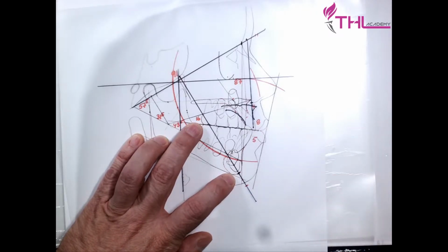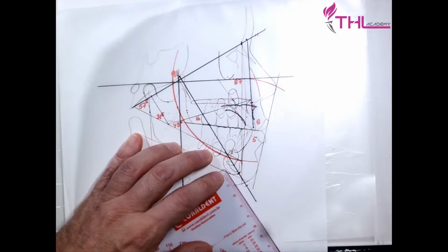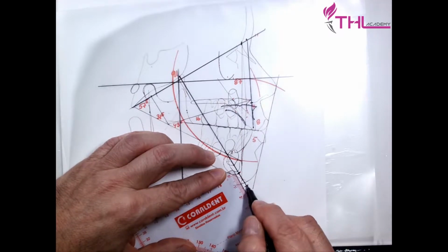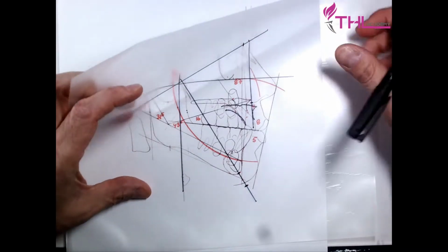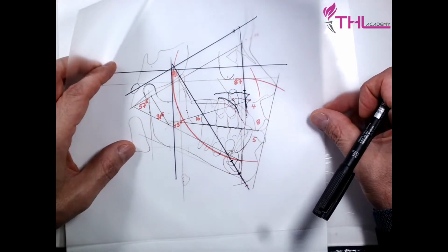Somebody can multiply please. 2.5 times 7 is 17.5. Okay, now I go back with this sheet of paper, sliding it along the facial axis.